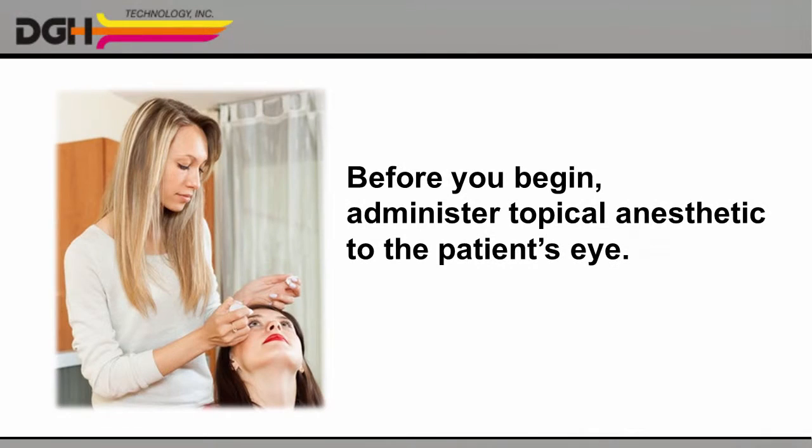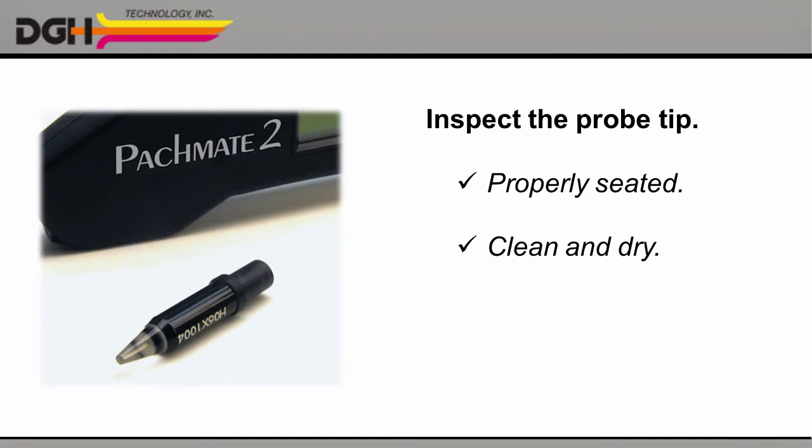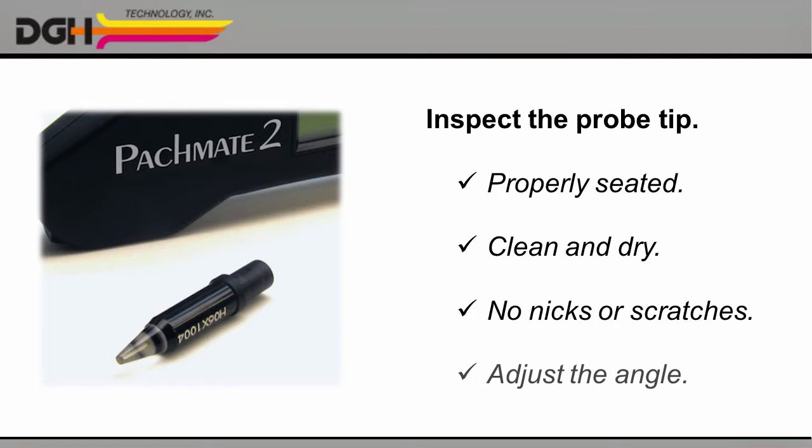Before you begin the biometry procedure, be sure to administer routine topical anesthetic to the patient's eye. Then inspect the detachable probe. Verify that it's properly seated in the probe rotator. Make sure that the tip of the probe is clean and dry. Be sure to check for any nicks, scratches, or other defects that could injure the cornea. And set the probe at a comfortable angle.